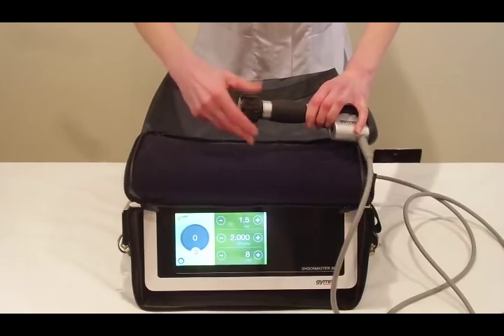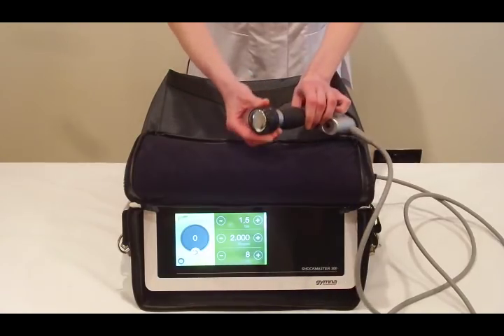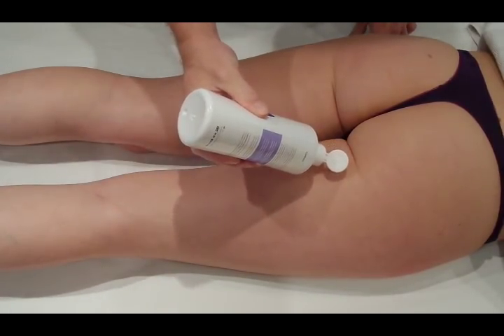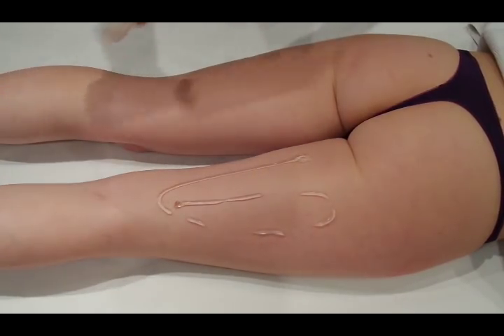The bigger head the better really for this sort of treatment — it covers a bigger area quicker. We're not going to use high power because we're not particularly wanting to go in very deep. We're only going to use a frequency above 15 hertz, as this has been shown to relax muscles and ease off tension in them.